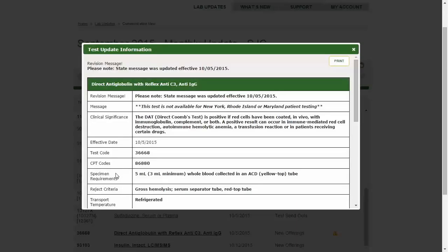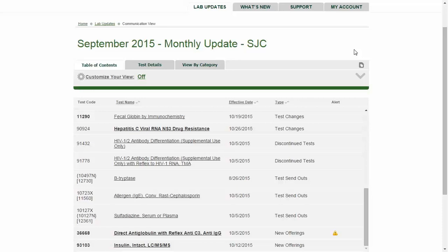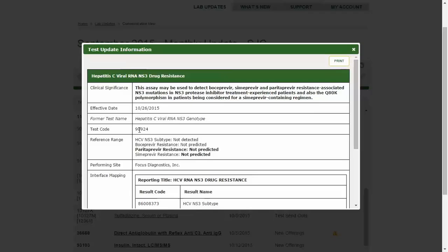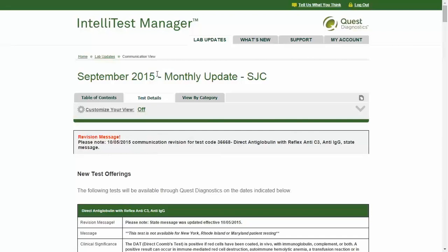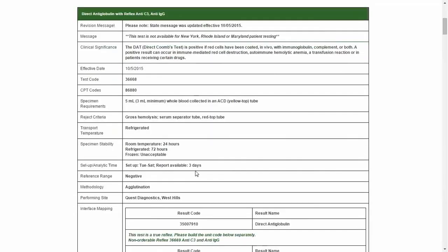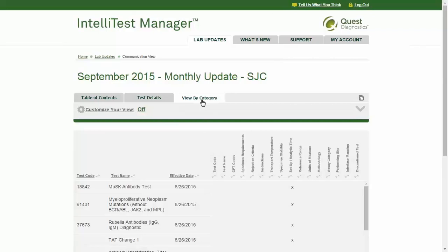Here you will find items such as CPT codes, specimen requirements, transport temperature, and interface mapping. Other types of communications, such as test changes, display only information reflecting the change being announced, and the change items will display in bold type. You can print information for just the particular test you are viewing. To view details of all tests covered in a communication at once, click on the Test Details tab. The View by Category tab allows you to sort based on the type of change — for instance, clicking the green arrow by a category title to reorder the list by tests with a change in interface mapping.